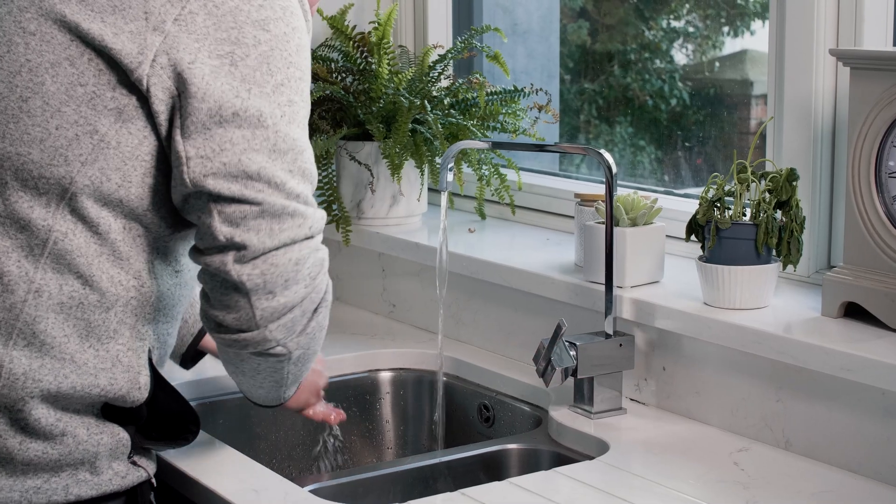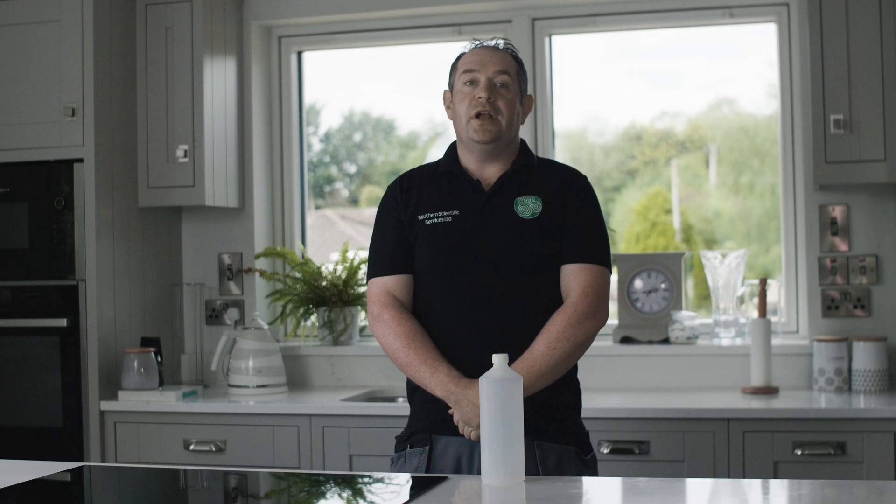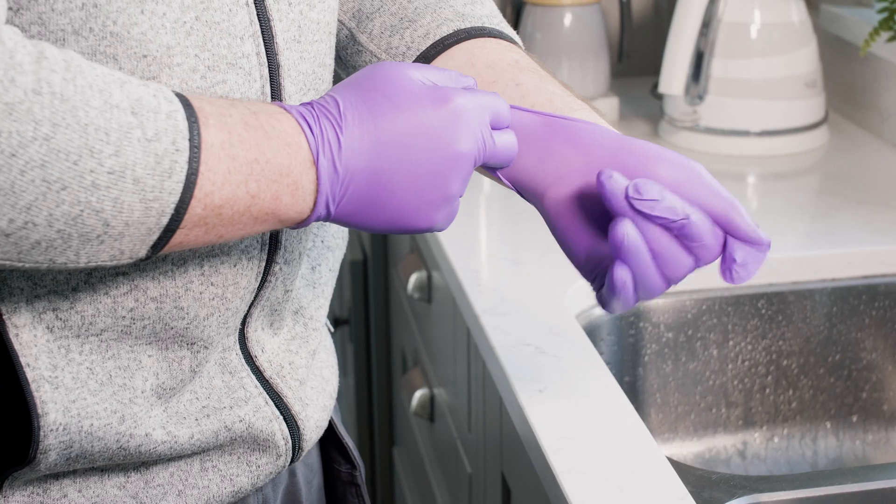3. Ensure your hands are washed well before sampling. 4. A fresh pair of gloves must be worn when sampling.